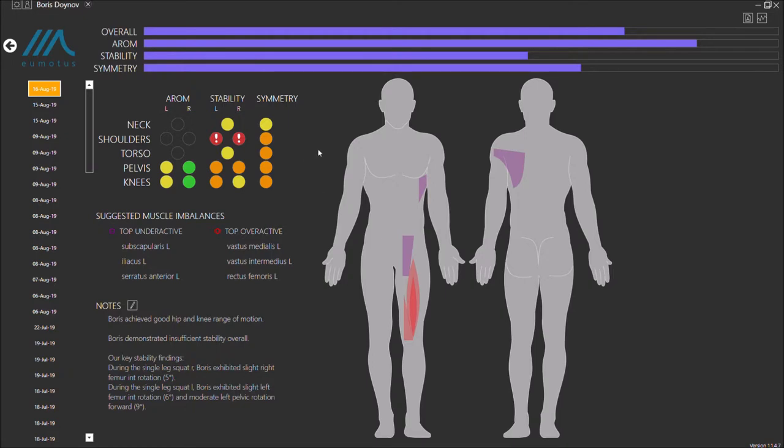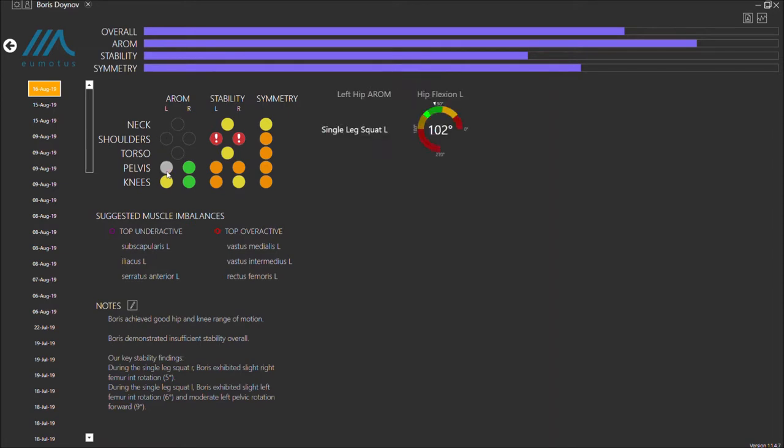For example, we see that Boris achieved 102 degrees of left hip flexion, which is low compared to the 113 degrees of his right hip flexion.